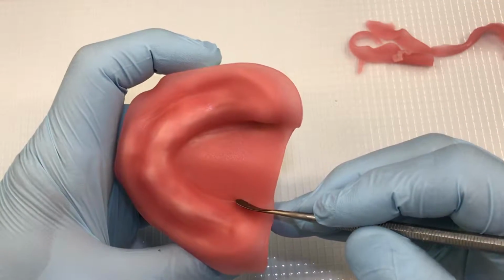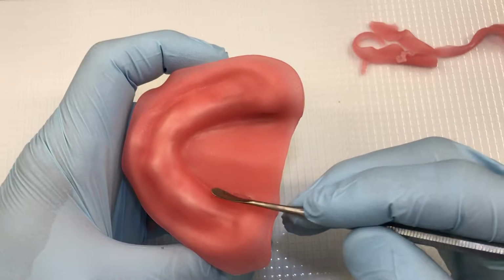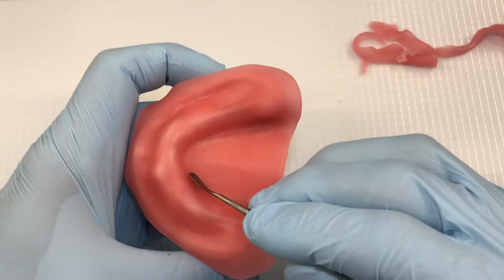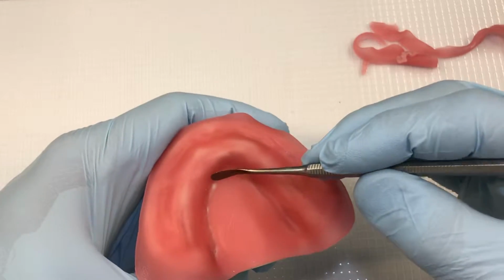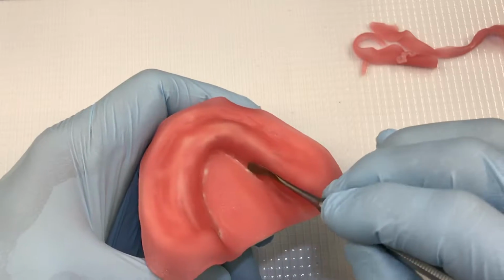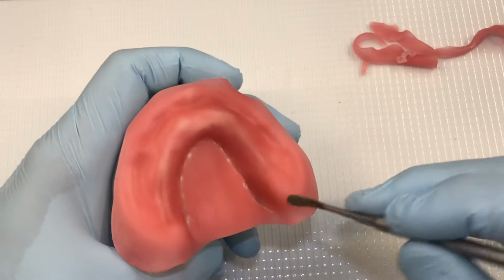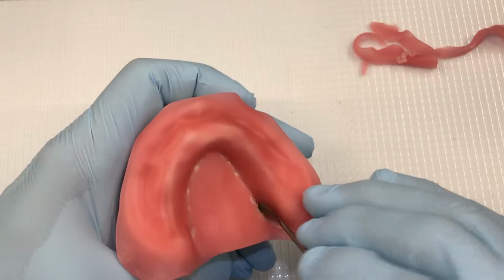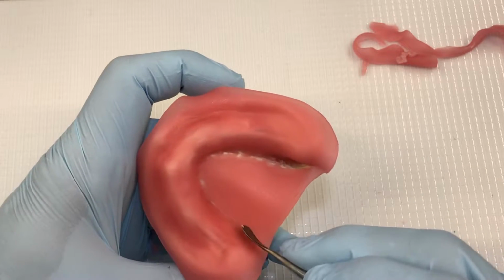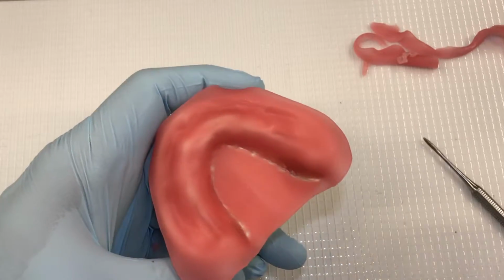So on the lingual side, once again, I'm going to take some material and pinch it towards the inside, as to not thin it out. Especially here where you have the severe undercut, make sure you push some material over and maintain the thickness as much as you can.